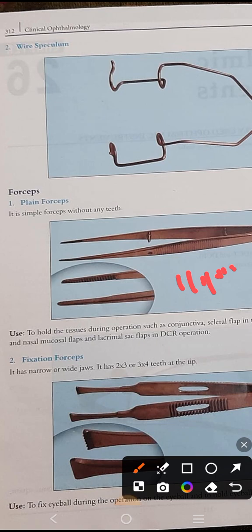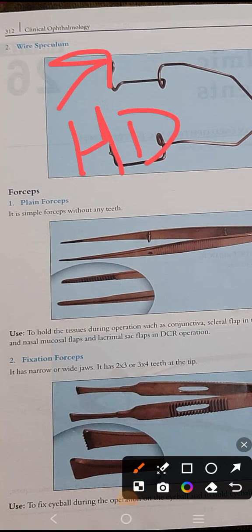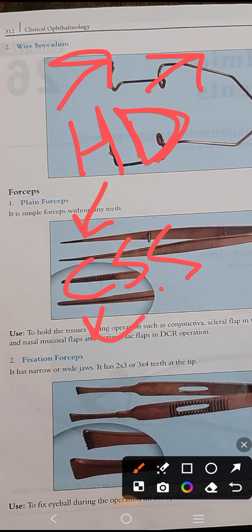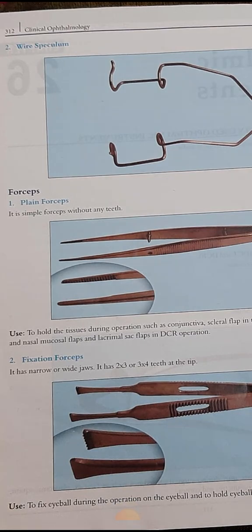For the plain forceps, remember the mnemonic 'HD': H means holding, D means DCR operation. Hold what? CSS — C for conjunctiva, S for sclera, S for skin. You can hold the patient's conjunctiva in various procedures, hold scleral flaps during trabeculectomy (which we perform for glaucoma — trabeculectomy means removal of the trabecular meshwork from the iridocorneal angle), hold skin during any eyelid surgery, and perform a DCR operation.